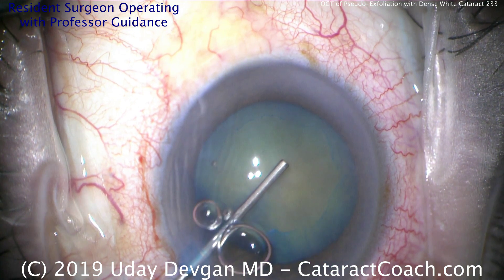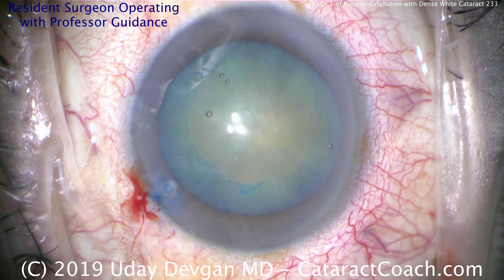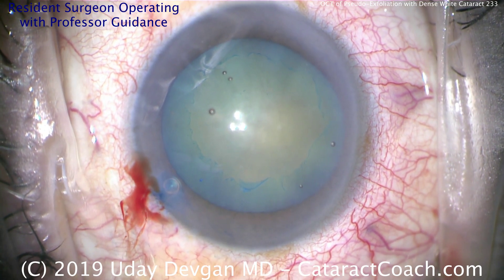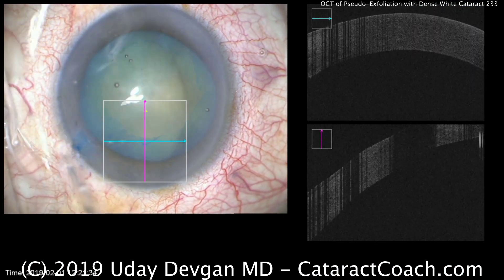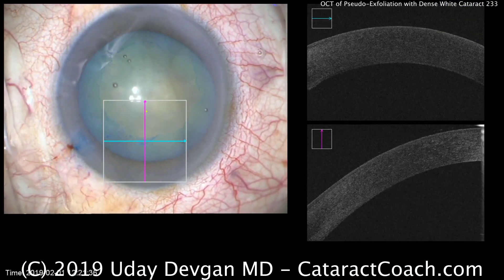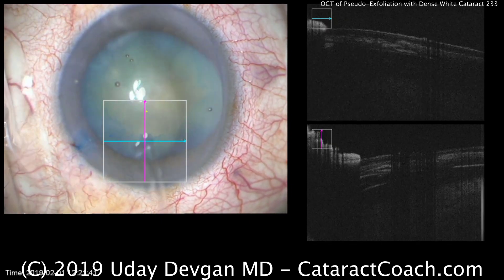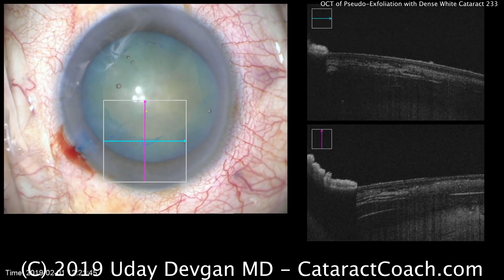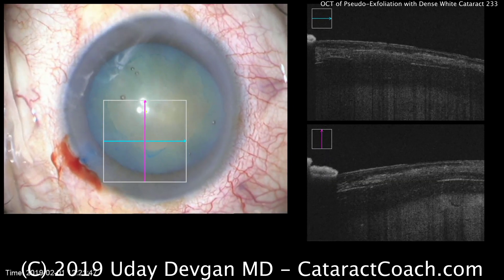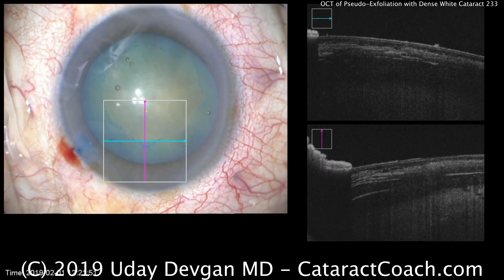We had a hard time seeing the pseudo-exfoliation material, but once we put in the Trypan Blue dye and fill the eye with viscoelastic, it becomes a lot more obvious. We can see that material on the OCT scanner — there's the cornea, the iris, and the lens capsule, and you can see deposits of pseudo-exfoliation material on the lens capsule, which is of course very, very thin.